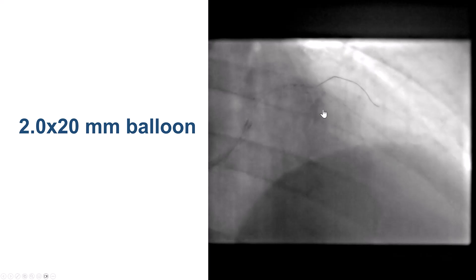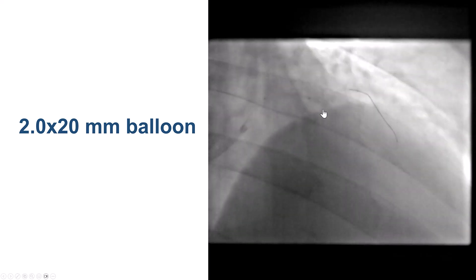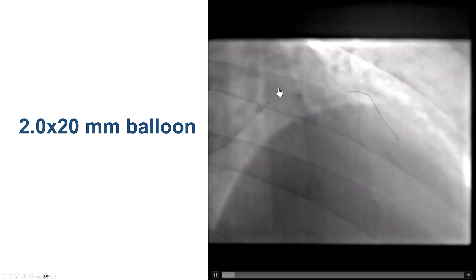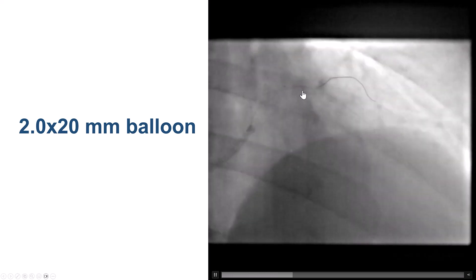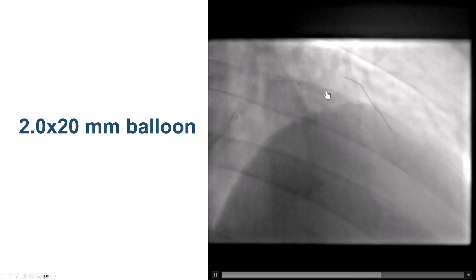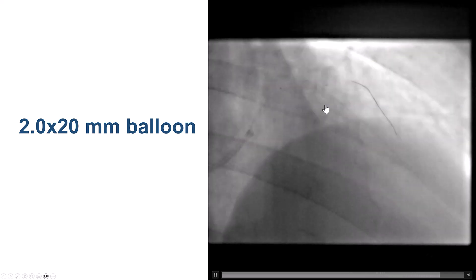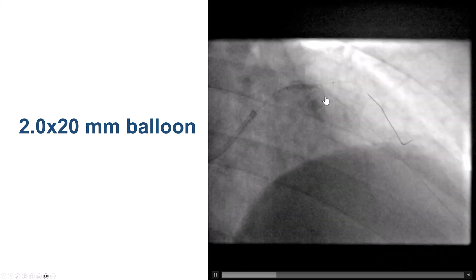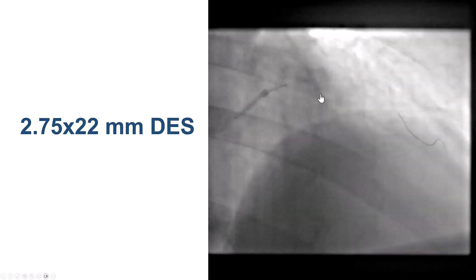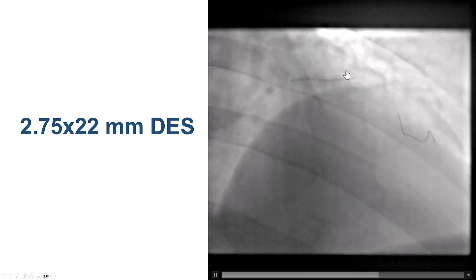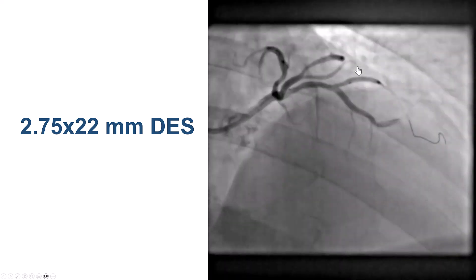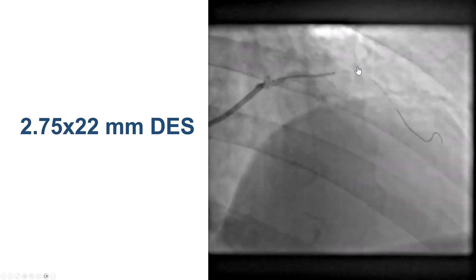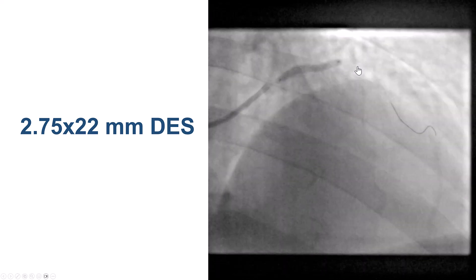One solution is the so-called reverse crush technique, in which we advanced a balloon over the jailed guidewire inside the diagonal branch, inflated it to crush the LAD stent, and then placed another stent from the LAD all the way into the diagonal branch. This is a 2.75 by 22 mm drug-eluting stent placed from the LAD into the diagonal. We confirmed good positioning and successfully deployed the stent, which provided a nice result.